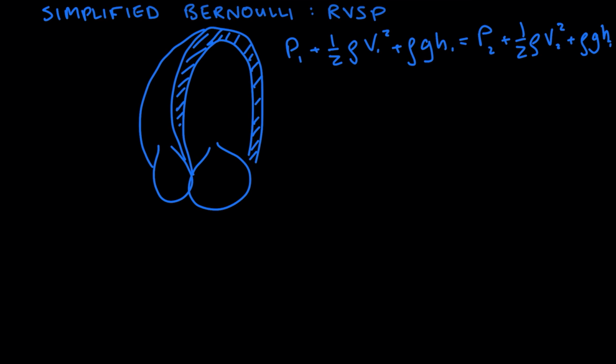And so we can pick two different points in the heart and use this equation to our advantage.